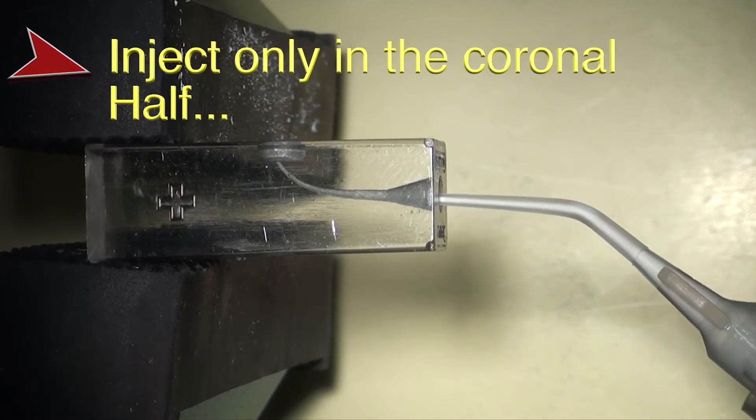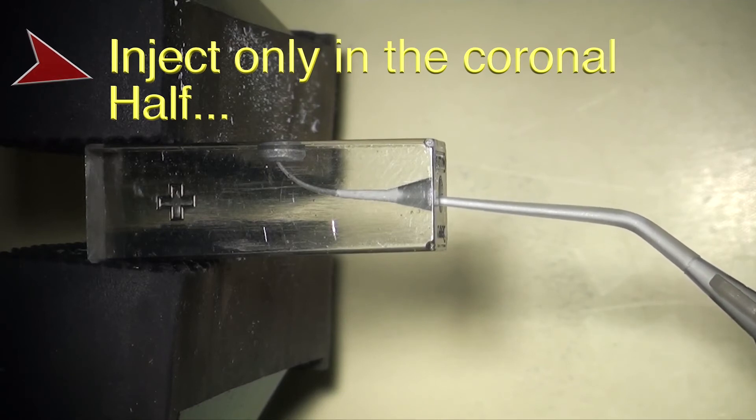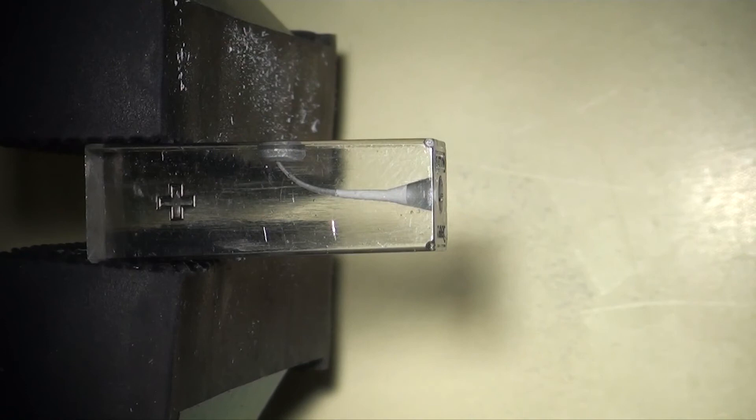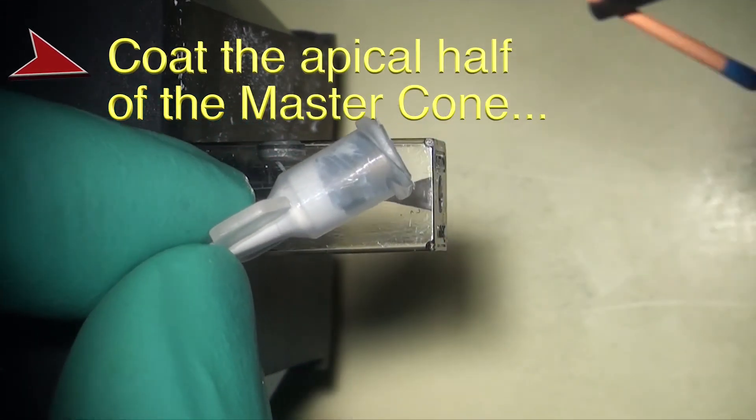If syringing the sealer into the canal, it is recommended to make sure that you only syringe in the coronal portion, and your tip should not be bound. We do recommend that you coat the cone prior to seating it to the apex.